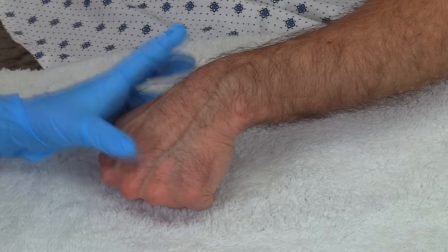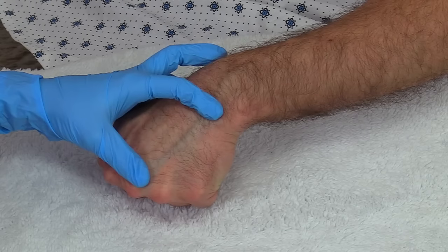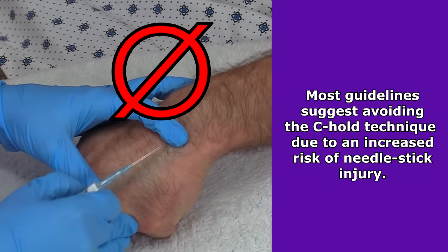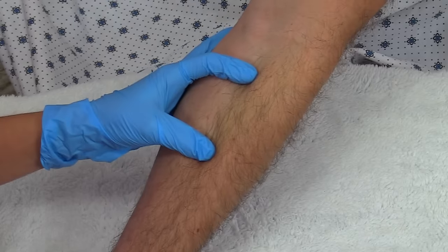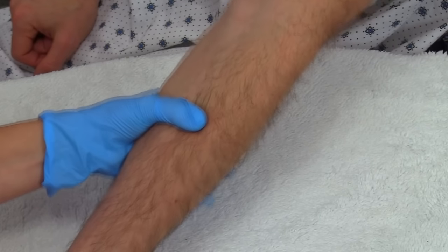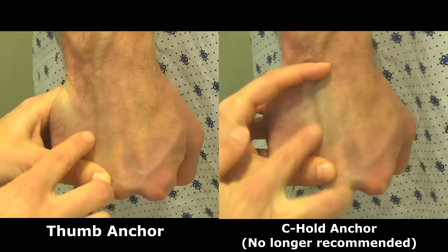Another technique some people use is called the C hold or C technique. With this technique, you use the index finger and thumb to stretch the skin taut and hold the vein in place as you stick. This technique also works to anchor veins; however, the newest guidelines recommend not using this method because there's a risk of needle injury to the healthcare worker. In addition, when you use the index finger and thumb in this position, it makes it harder to hold the extremity steady with the rest of your hand. The thumb anchoring technique makes it much easier to grasp the limb and hold it steady.